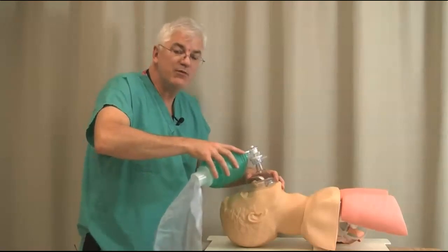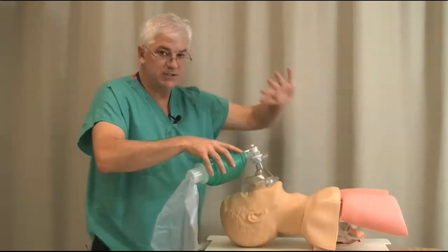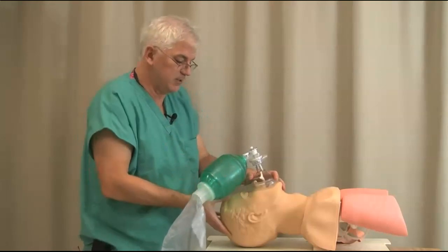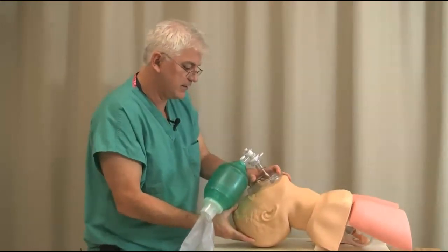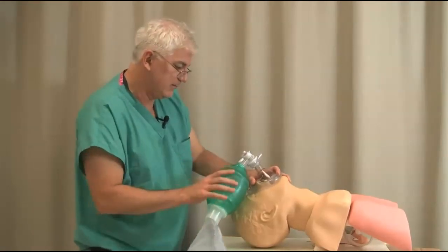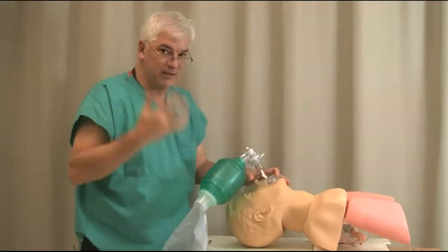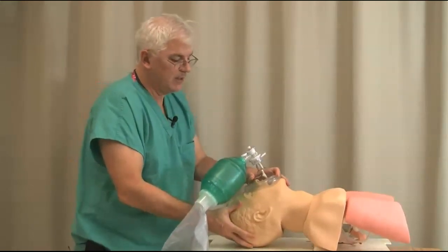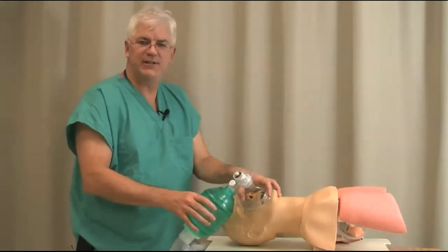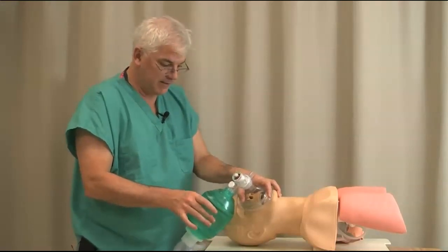If you see that you're not moving air, if you don't see end-tidal CO2, if you have access to that, if you don't see the chest rise, if it just doesn't feel right, then adjust something. Adjust their head. Notice how I extended. Again, can't do that in case of neck injury. Extend the head, see if that helps. If that doesn't help, here's an old trick that I've only seen in one book, and the book I wrote. Tilt their head to the side. A lot of times when people can't mask, if you just tilt their head to the side, for some reason, I don't know why, it really helps.